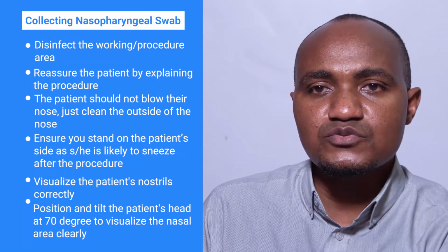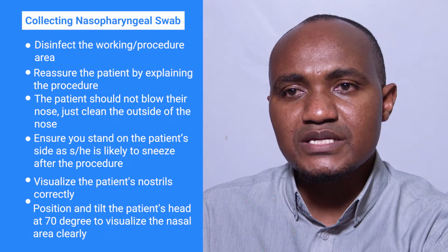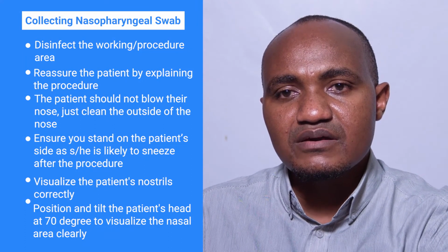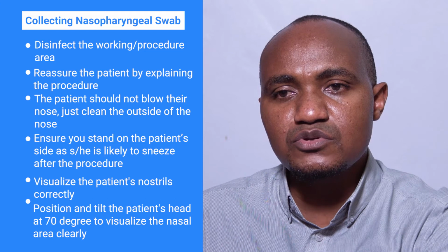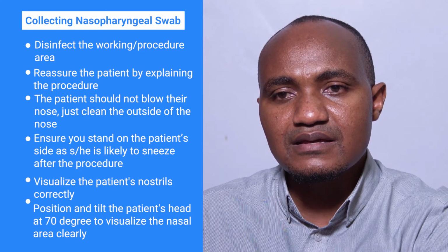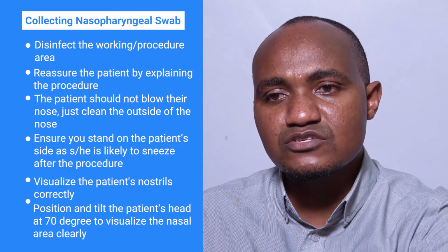Collecting the nasopharyngeal swab. This will be demonstrated and explained in steps. You disinfect the working procedure area. Then you reassure the patient by explaining the procedure. The patient should not blow their nose, just clean the outside of the nose. Blowing the nose may lead to less optimal samples.